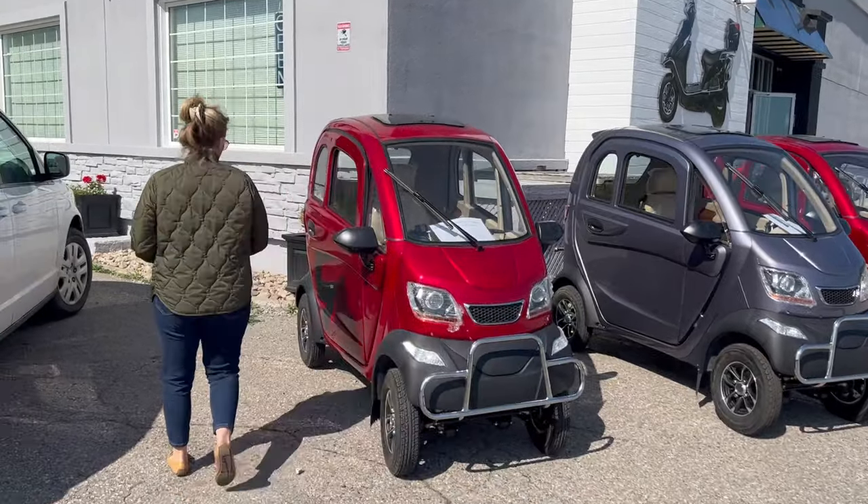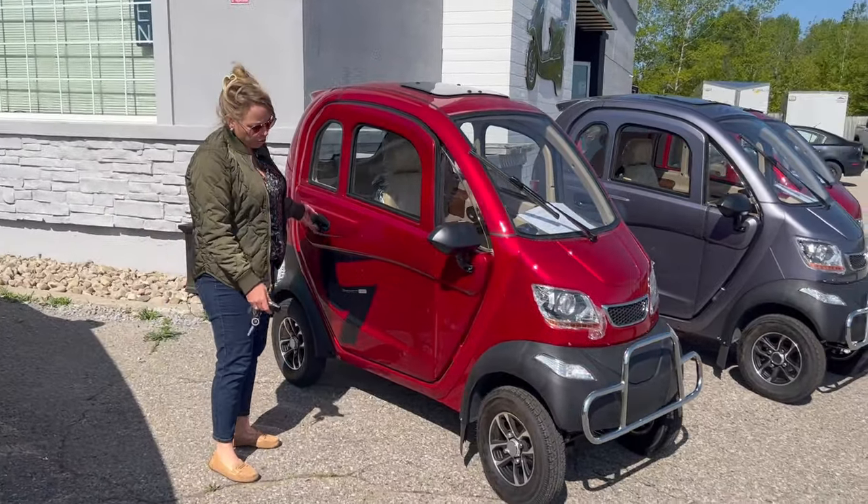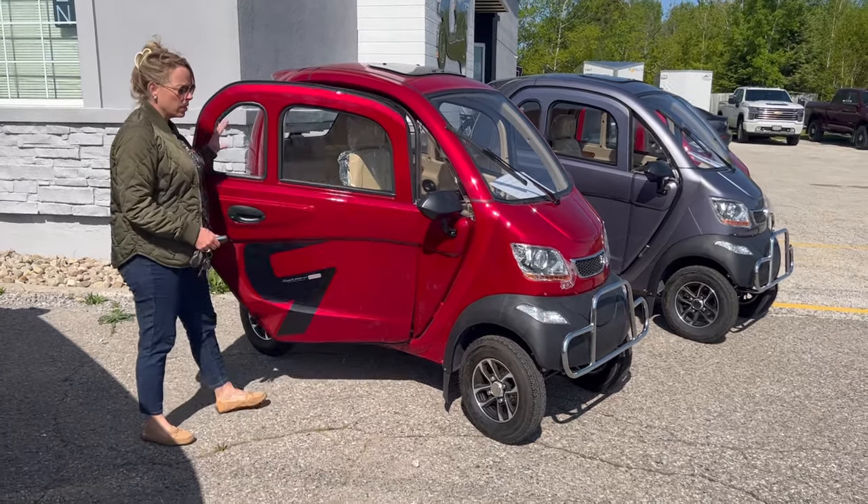All LED lights. 10 by 3 tubeless tires all around, same size.